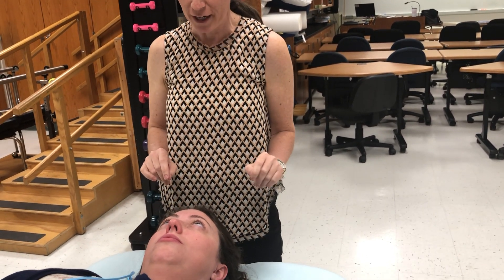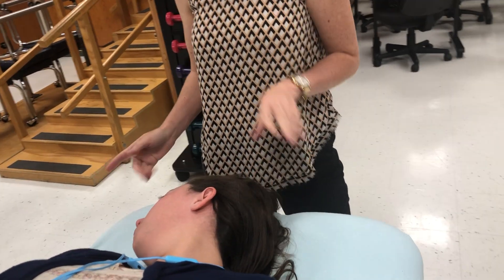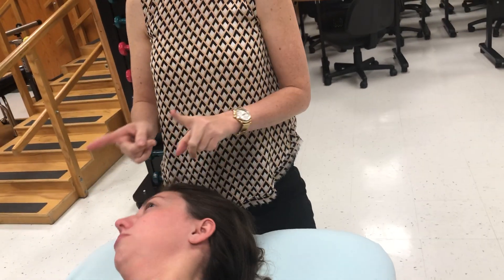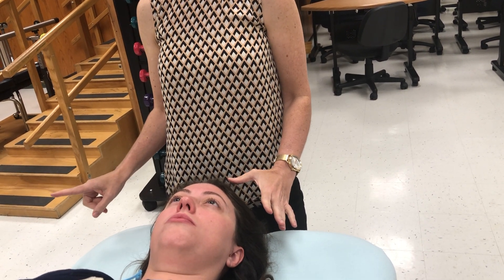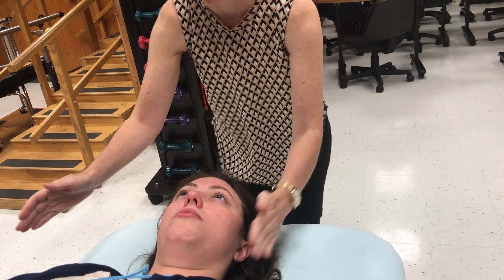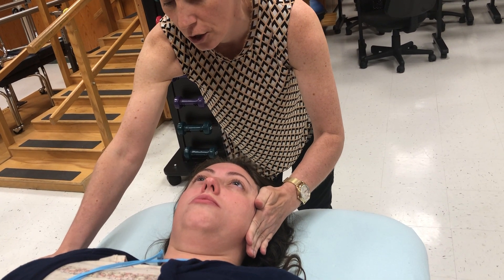Let's start again. Turn and look all the way over your right shoulder — that's the starting position. Grade 3 is against gravity. Now we're testing left rotation. Stay right there — I'm going to try to push your head back to the right, don't let me do it, stay strong. Resistance hand in front of the ear and side of the head, stabilization hand on the contralateral shoulder.